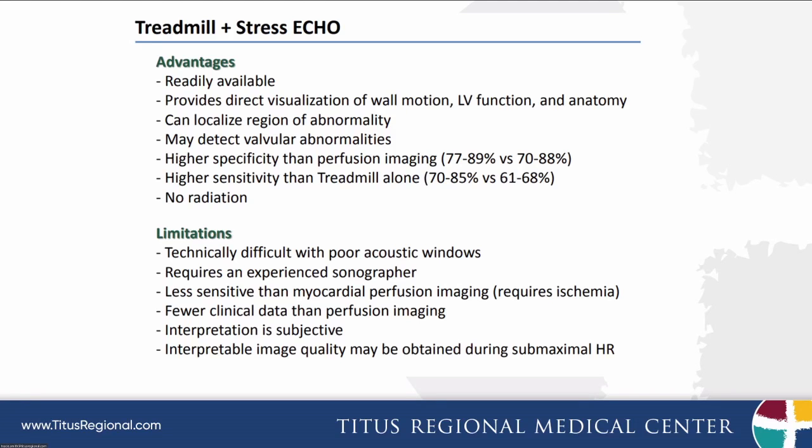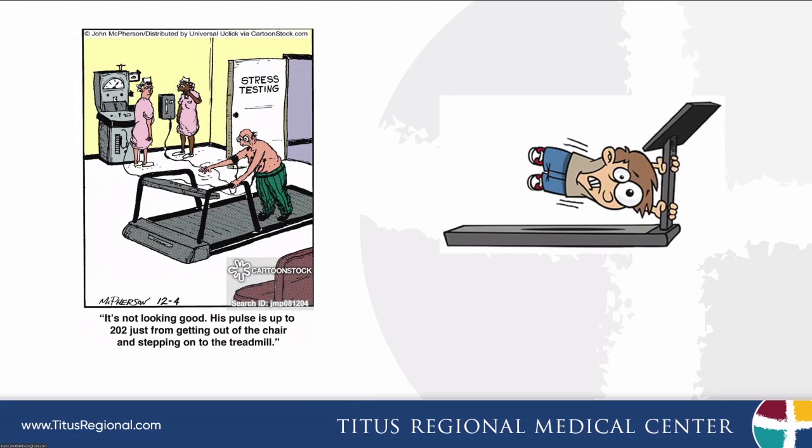The limitations are that not all patients are easy to image with echo machines, and it requires a very experienced echocardiographer to be able to image the patient within that 60 seconds while their heart is maximally stressed and their heart rate is still elevated. Again, not all patients are going to be able to walk on a treadmill, and that's a potential problem as well. So we've developed other schemes where we can do different types of stress tests with patients who are not able to adequately walk on a treadmill.